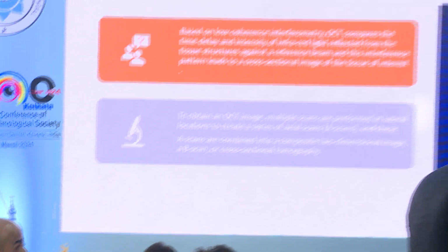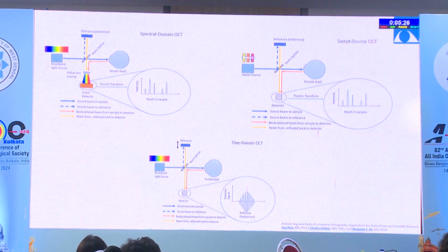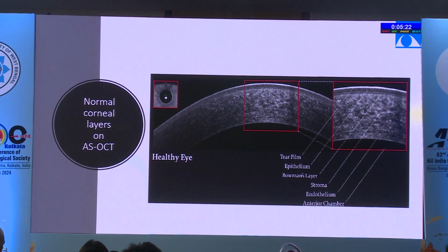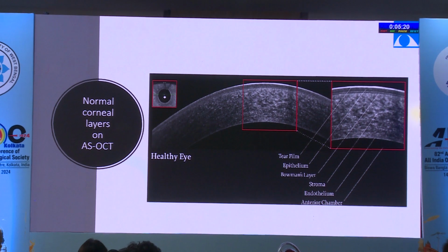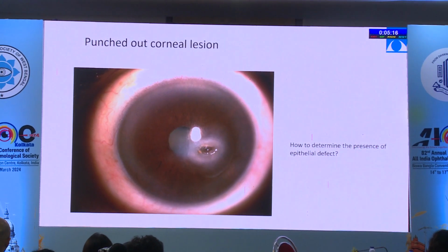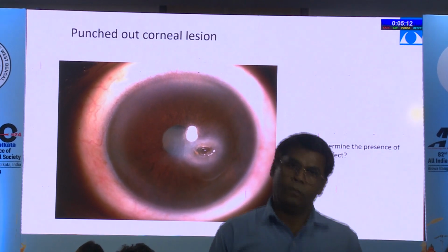I'm going to quickly take you through some situations where the ASOCT and MS39 in particular have helped me in clinical diagnosis and treatment. I'm going to be dealing with the ASOCT part of the ensemble. We know it provides an optical biopsy of the cornea, and these are some cases where it has really helped me. This is a patient with a long-standing corneal scar who came with a central melt.